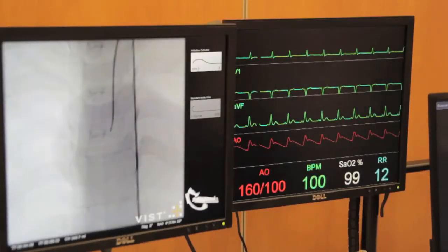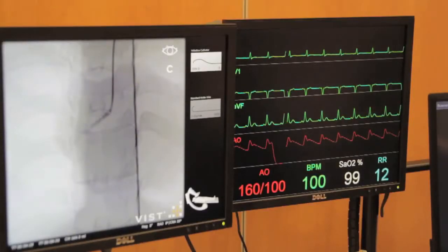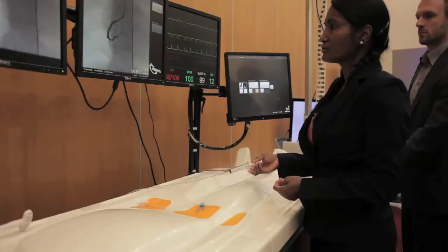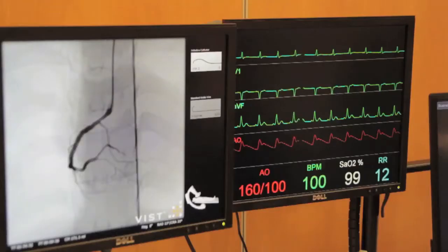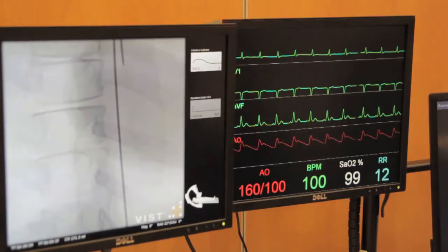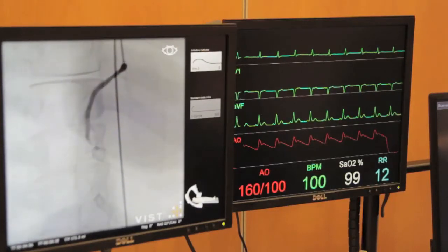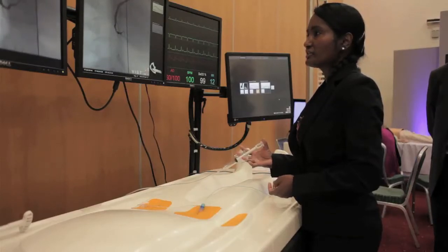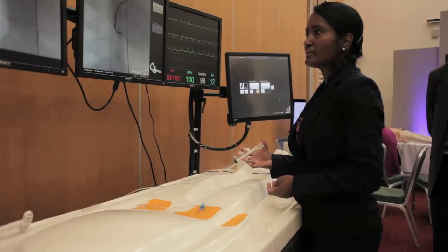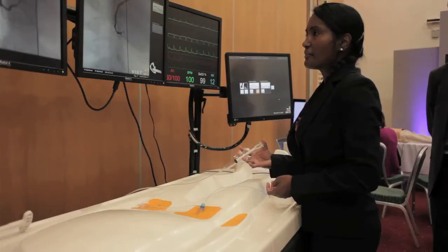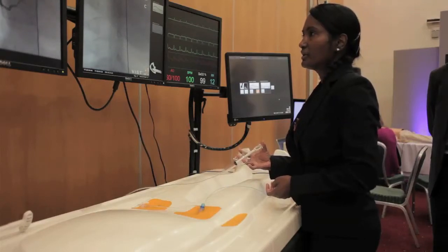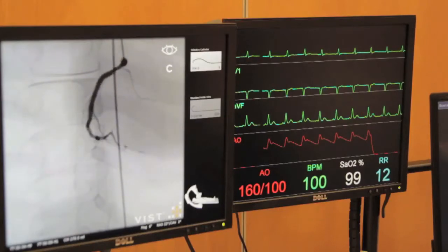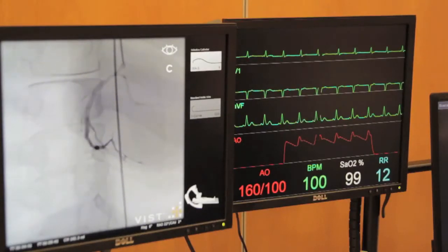We acquire the image, and one of the views that we commonly do is the RAO view. A small test injection is done to confirm you are still within the coronary artery, because sometimes with movement of the table or patients taking a deep breath the catheter might have come out. Once you confirm that the catheter is still within the coronary artery, then you acquire an image.